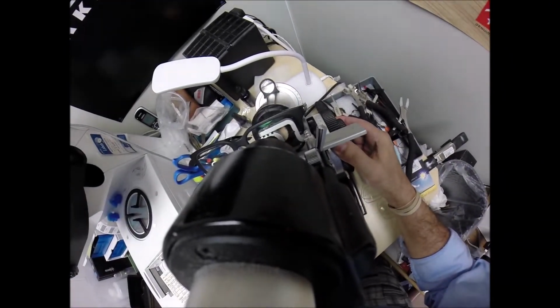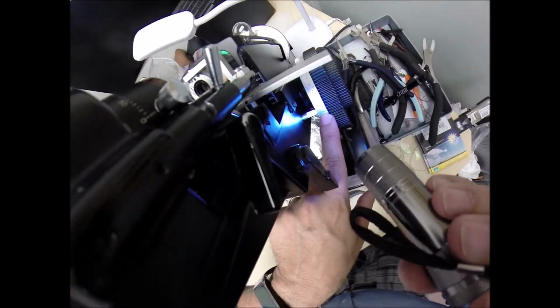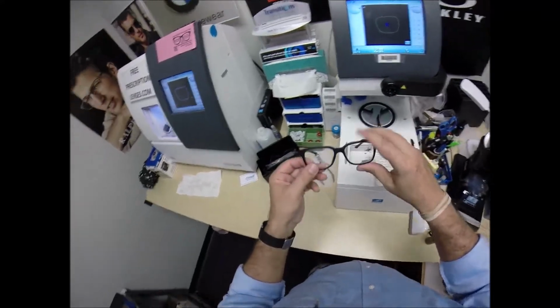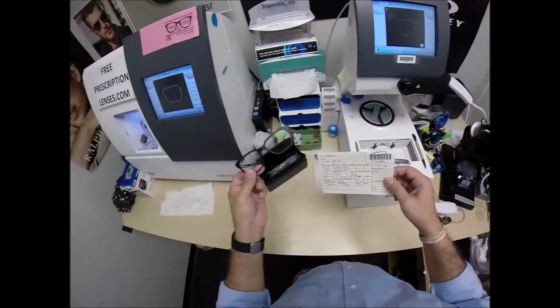Now again, you have 2.5 diopters of astigmatism correction. Let's check that. And we're at minus 250, exactly halfway between 2 and 3. Now, whoever cut these lenses did a pretty good job. I couldn't have done a better job if I'd cut these lenses myself.